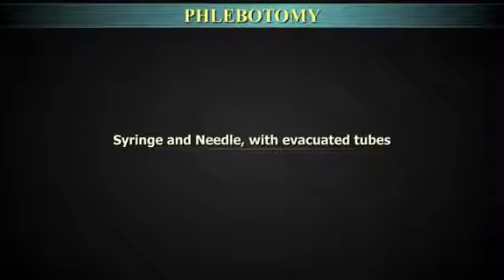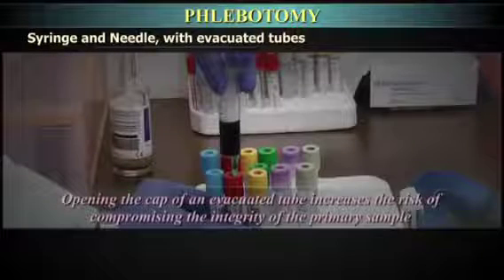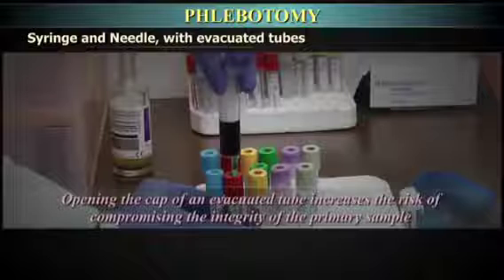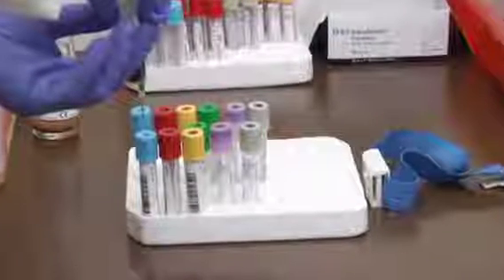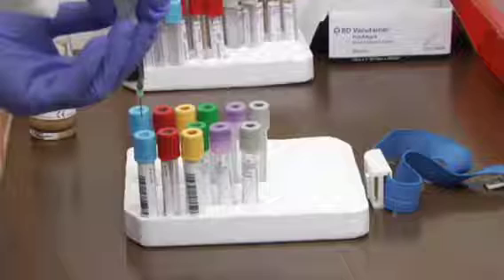When using syringe and needle with evacuated tubes, opening the cap of an evacuated tube increases the risk of compromising the integrity of the primary sample. If a syringe is used, it is recommended to place the tube into a rack before filling the tube.